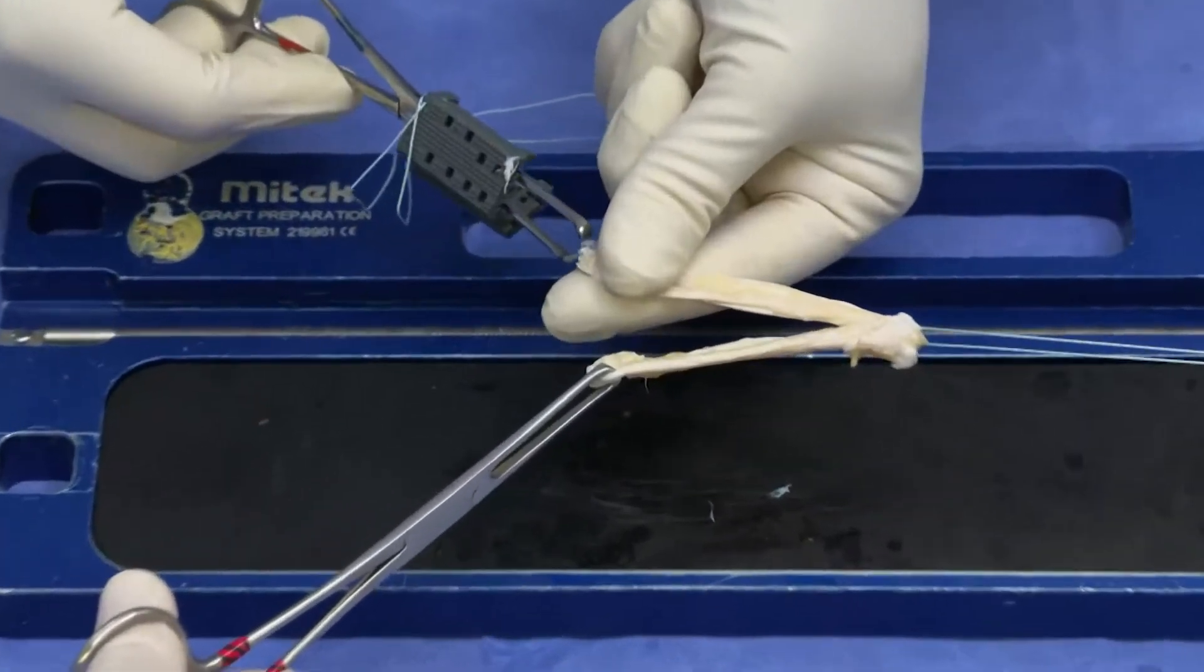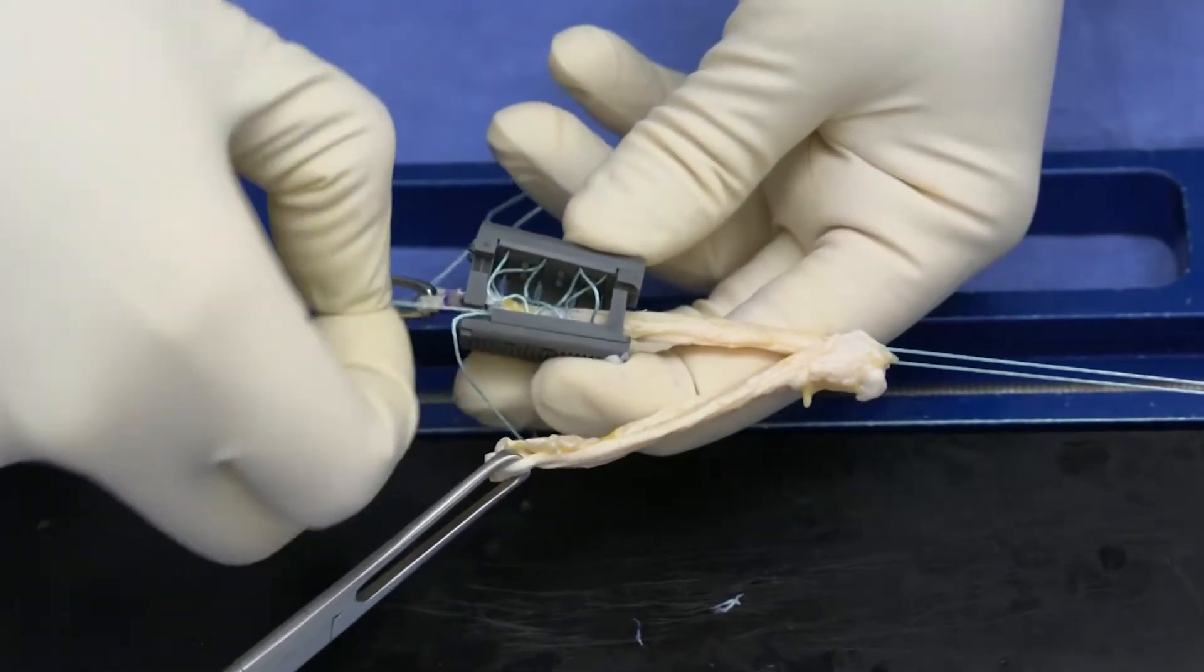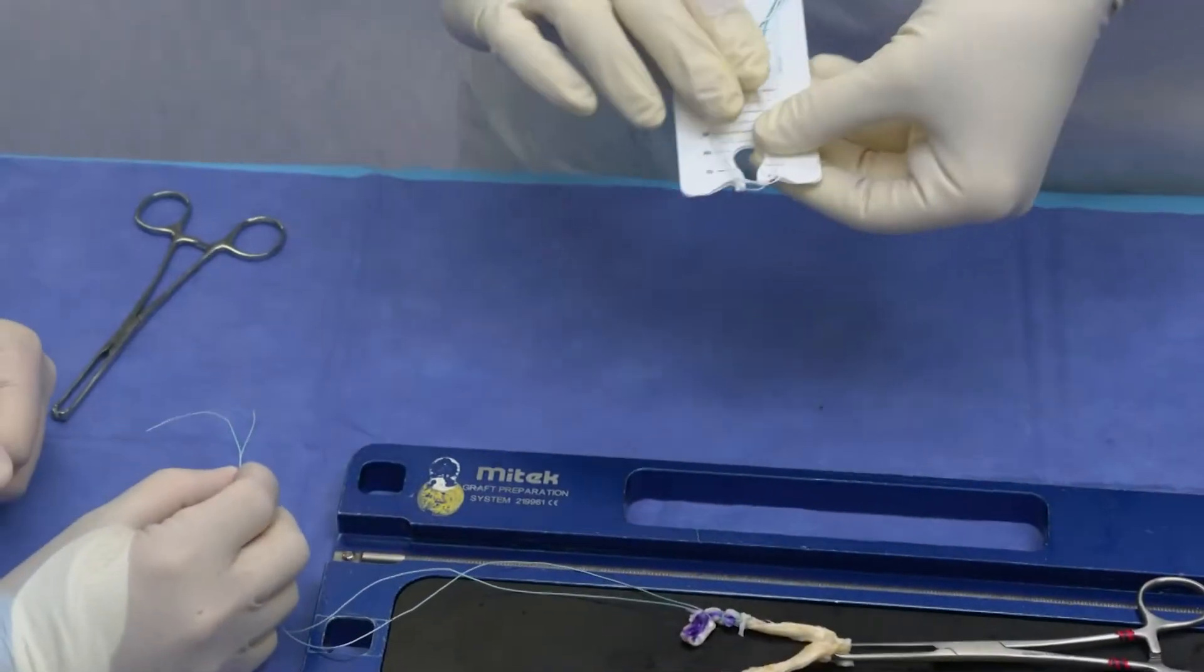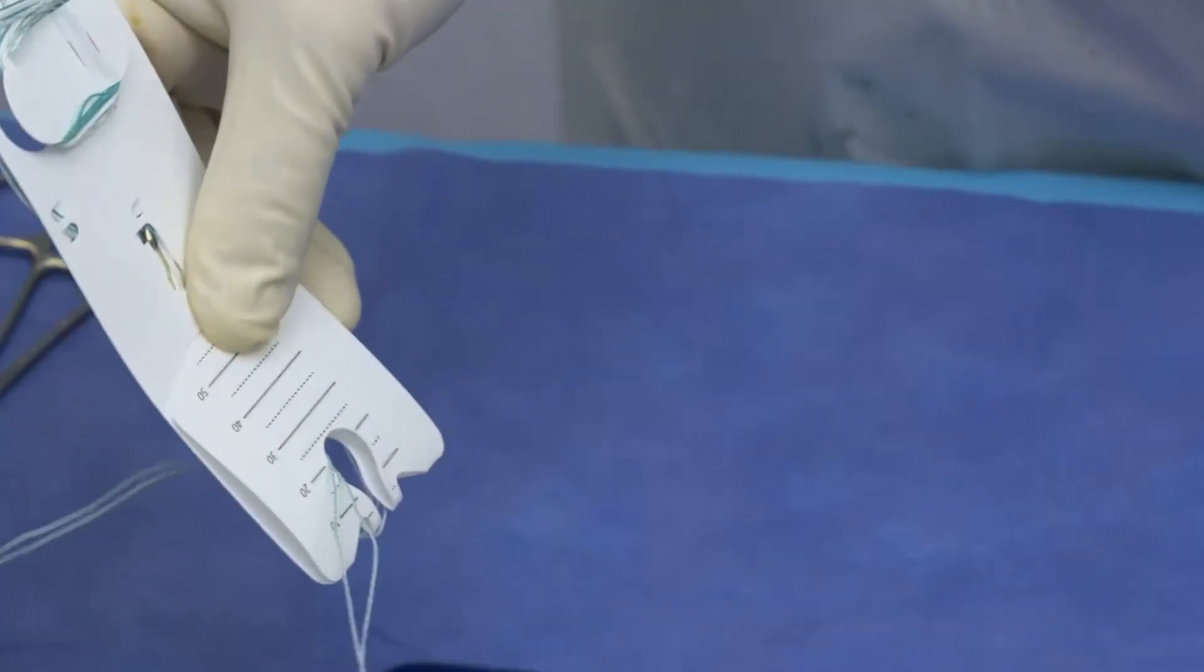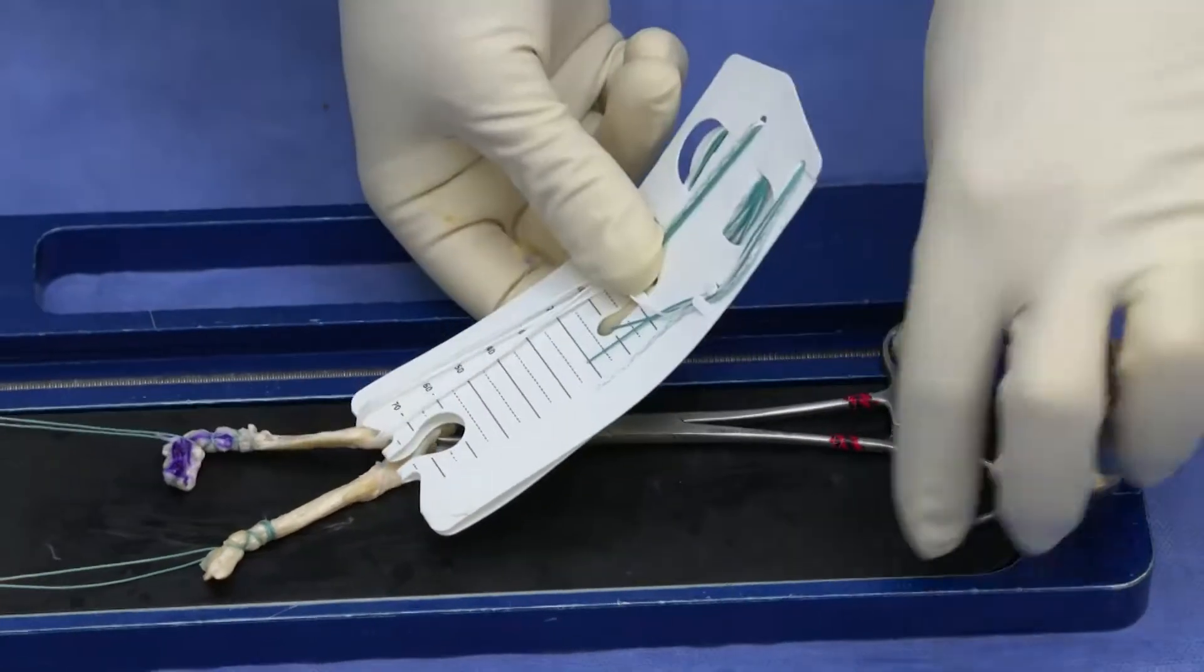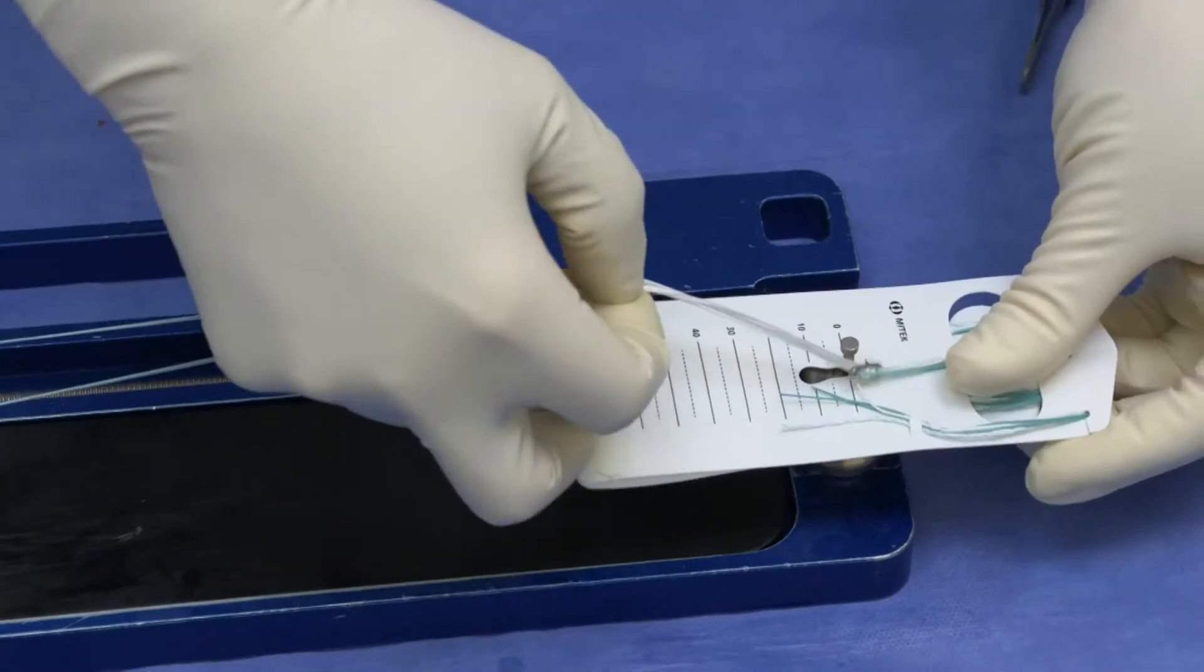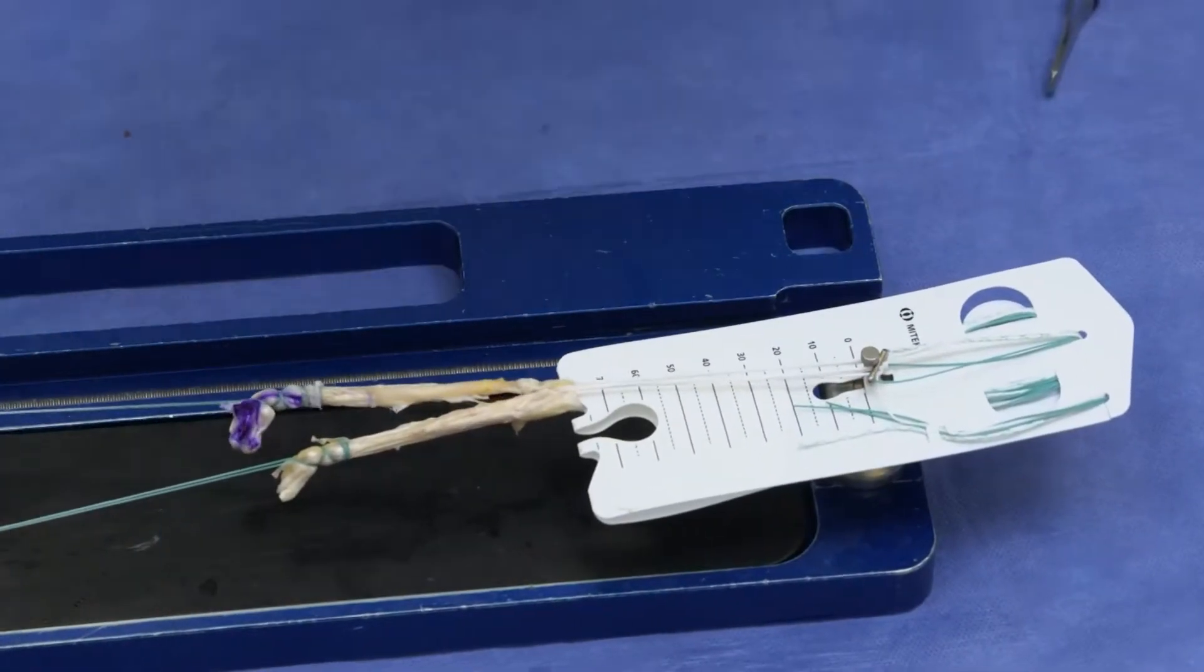Grab the end of the tendon, pull it through, squeeze it, and then we'll pull each of the ends to secure it down. Okay, so we got our two limbs prepped. We're gonna pass the suture and then one limb through the center of the card and the rigid loop adjustable, and pull that through with your left hand. Then we can undo this Alice clamp. The card's got a little hole we can use around the graft prep board just like so. Make sure the button goes through the center as well. We have our Dyna loop ready to go. We're gonna pass that through both limbs on your end.